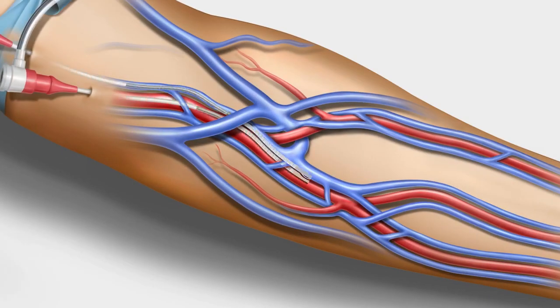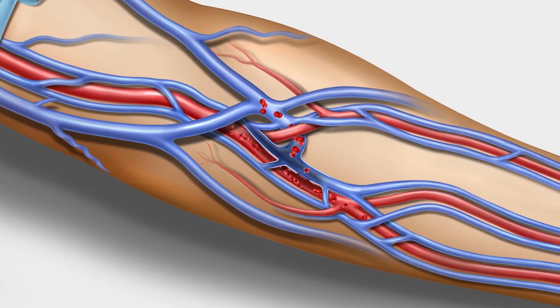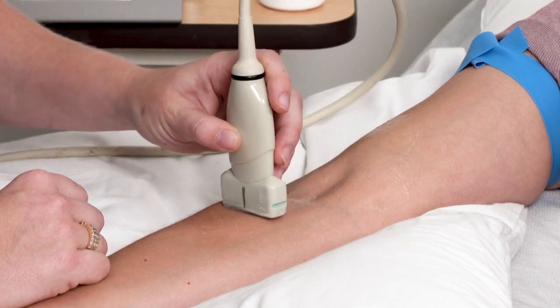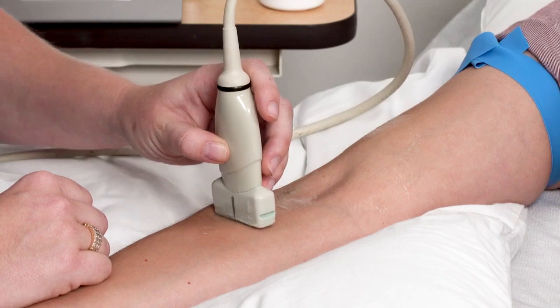The WavelinQ EndoAVF system uses two thin, flexible magnetic catheters and a short burst of radiofrequency energy to create an AV fistula without open surgery. Patients considered healthy enough to have a standard endovascular procedure qualify for further assessment for the WavelinQ EndoAVF system procedure.